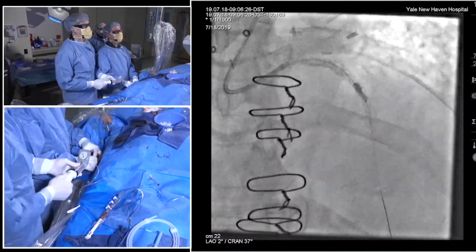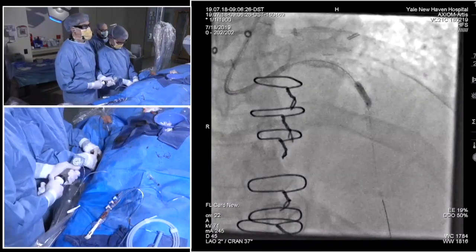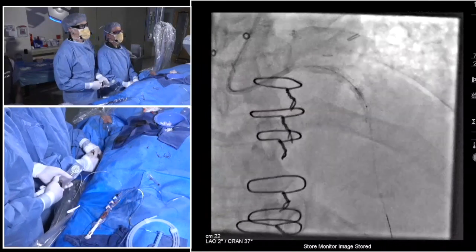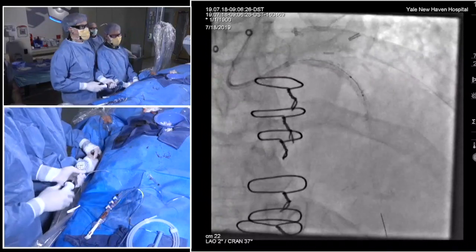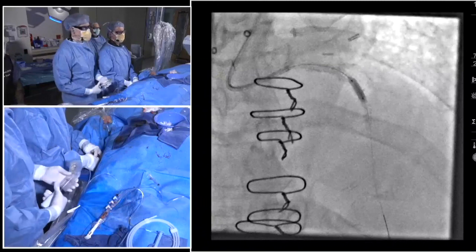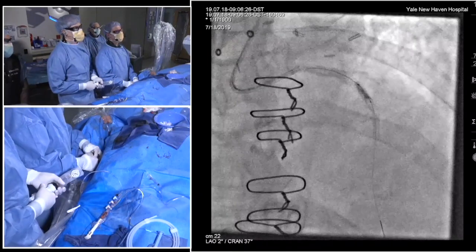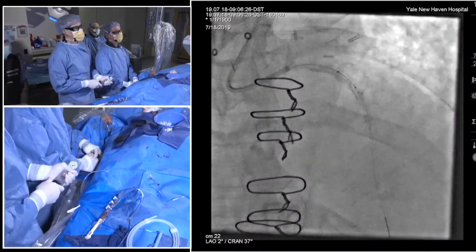But here, this is great lesion prep. So pre-atherectomy, pre-ballooning, and post-ballooning, and you're going to maximize your minimal stent area and outcomes for her, because she's going to stop her DAPT early, I'm sure, in anticipation of transplant. Without this imaging-guided post-dilatation approach, you'd be a little bit more worried about it, whereas I think you can feel more confident this way.